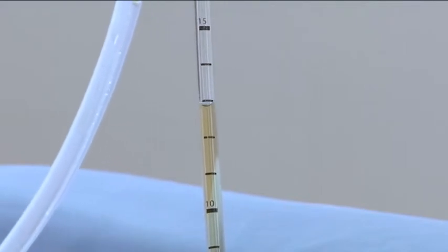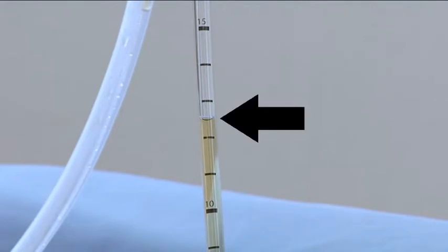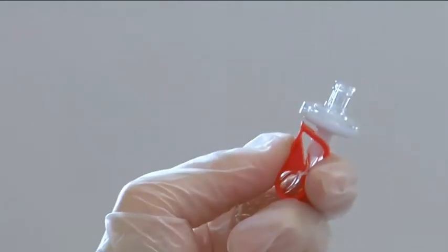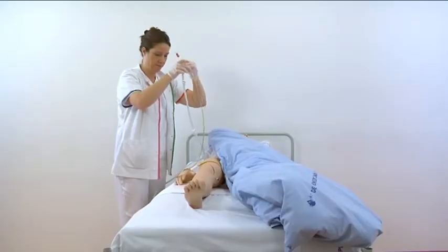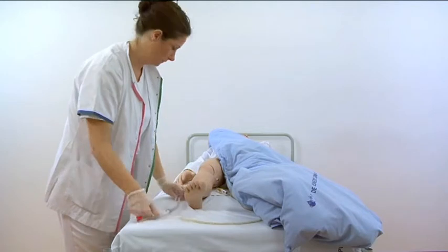Read the urine level at the end expiratory state. Close the red clamp at the unometer abdo pressure and place the tube around the leg of the patient.